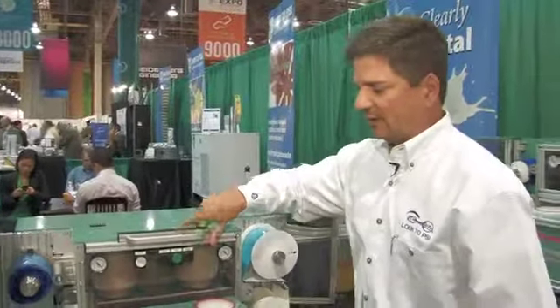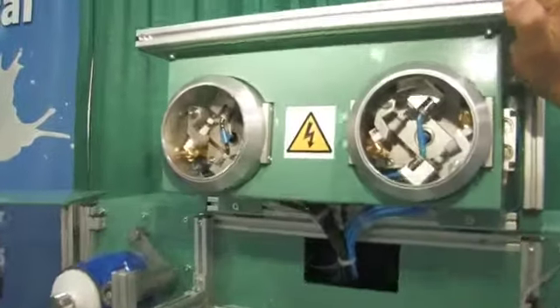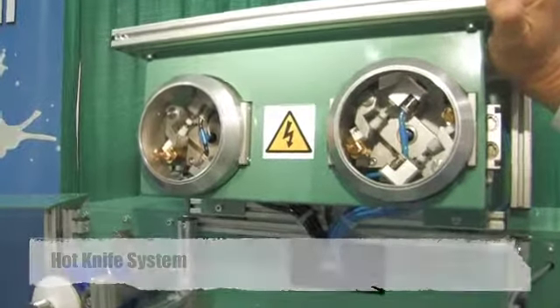With the new ASTA, we have the hot knife system. With this system, you get a much cleaner cut with less debris, and it also takes into account the gate on the polycarbonate lenses.